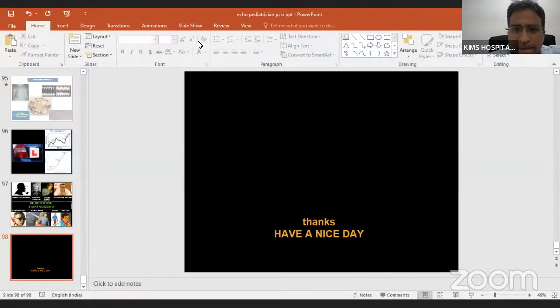Now this is in general a small synopsis, and now we'll go to the patient side and show you how to do the basic echo and the other things we learned. Thanks a lot. So now we'll go to the patient side and then we'll show you.